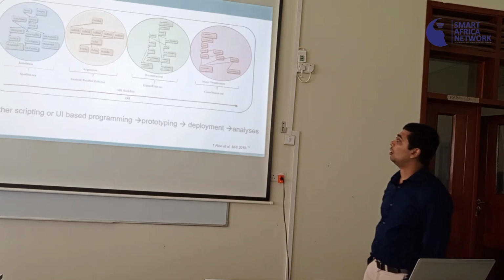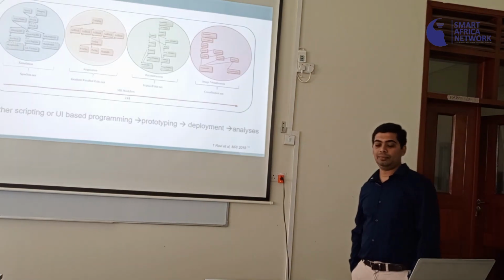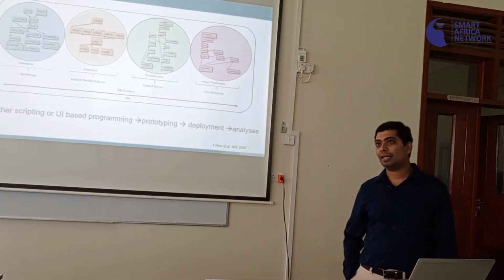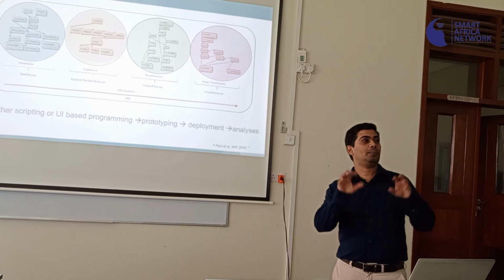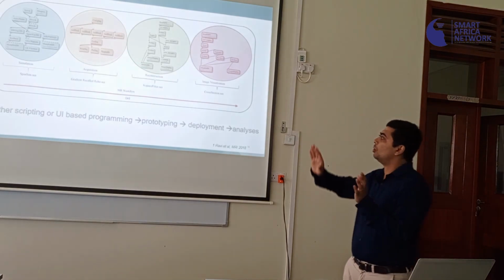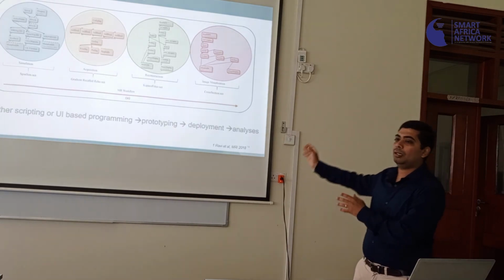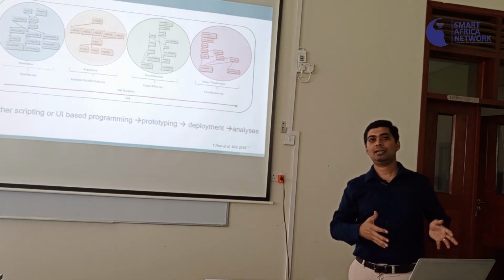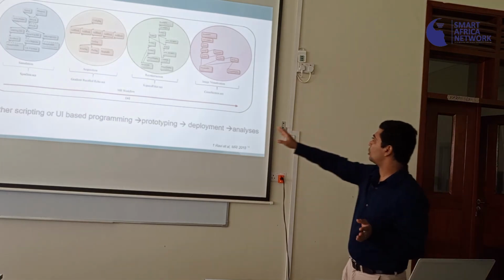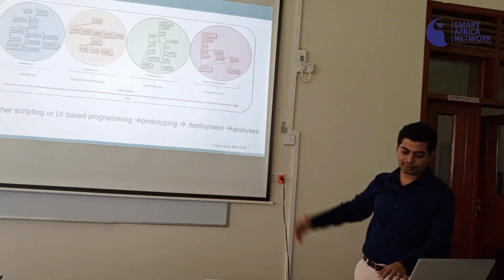With that, we've given this to a bunch of students at the undergrad level who can put blocks together like in Legos, and then be able to do the whole pipeline, once the hardware is ready, get through and build the whole software pipeline starting from simulation all the way to visualizing data.